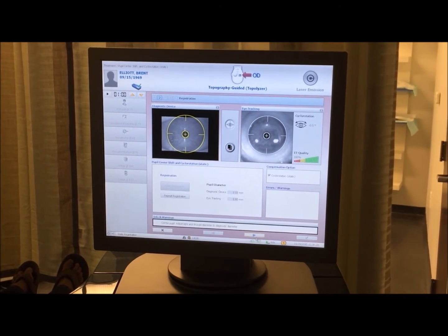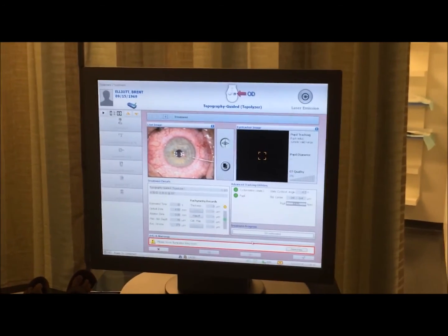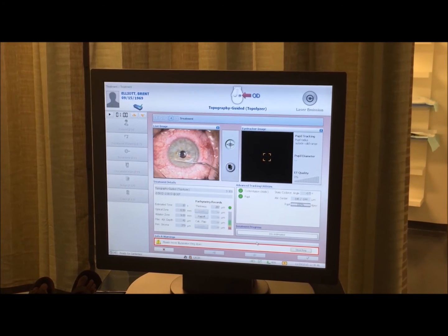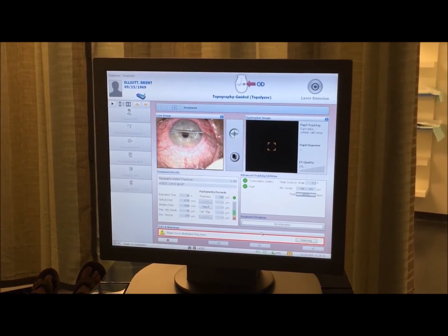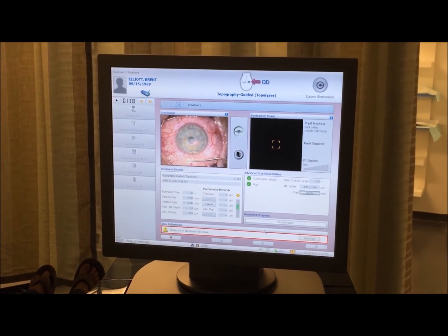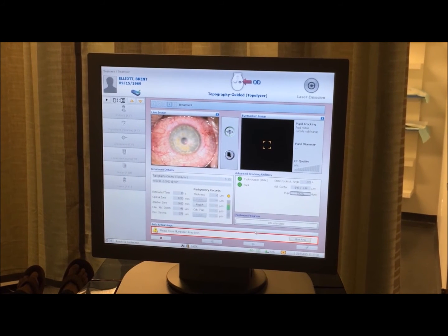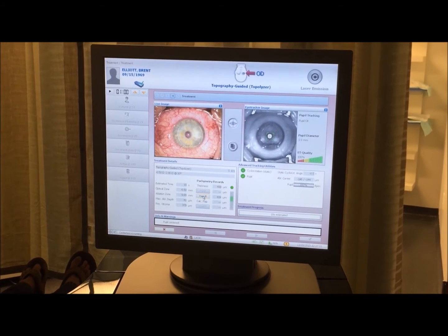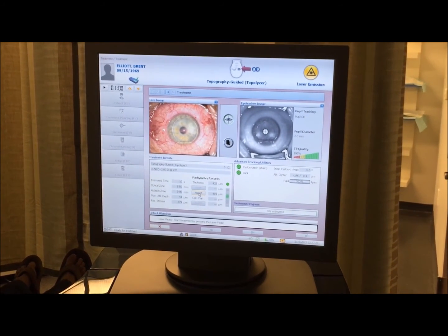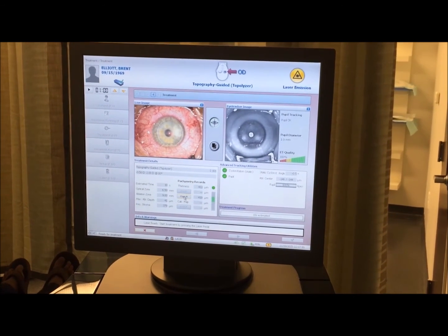When registering the patient, we need the pupil size to match what was seen in the diagnostic room, so we turn the lights down low. Lifting the flap is a basic typical lift — these flaps are easy to lift. I like a bit of a velcro feel, which I think reduces energy into the eye. I like a true nine millimeter flap, and I typically taco the flap back into position to protect the hinge, because these are huge true nine millimeter treatments. We want to make sure we're not ablating into the flap stroma and inducing a refractive error. The tracker is working for you and doing a lot of that work.